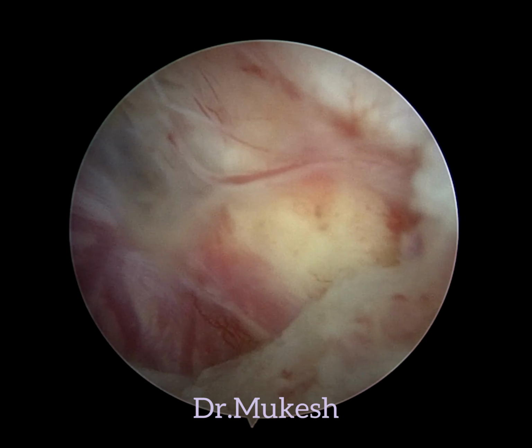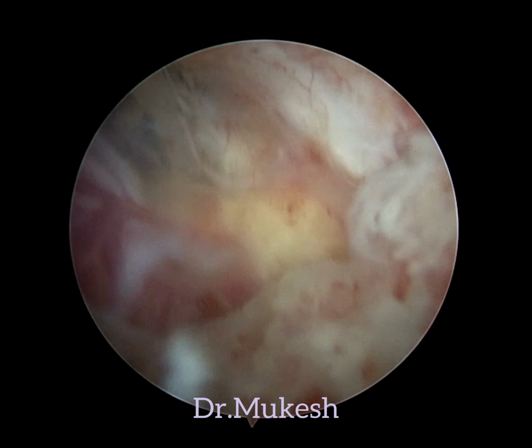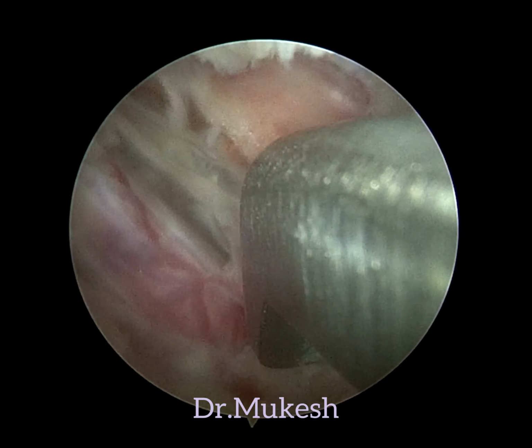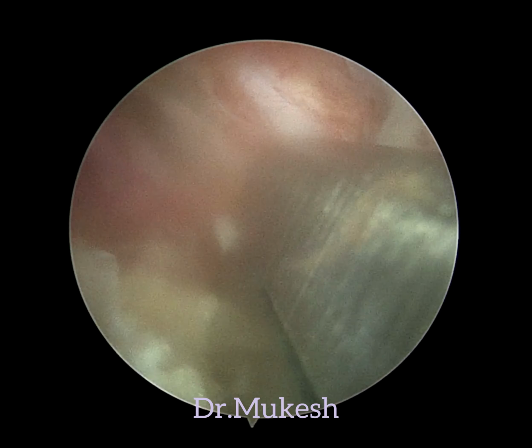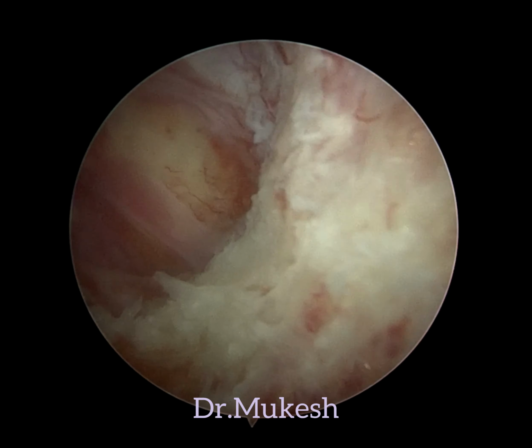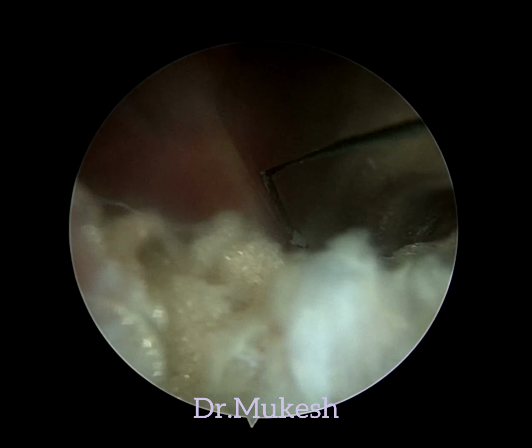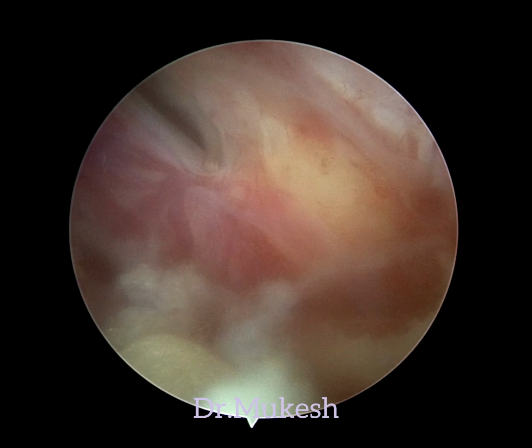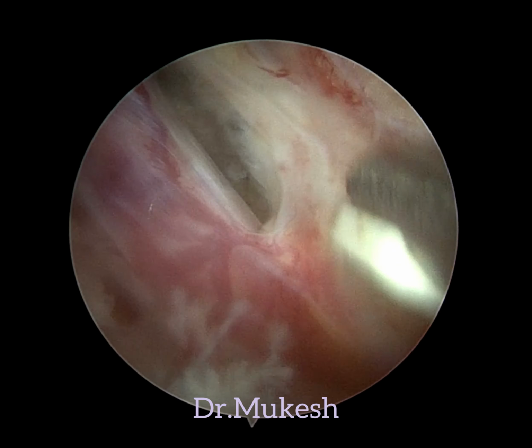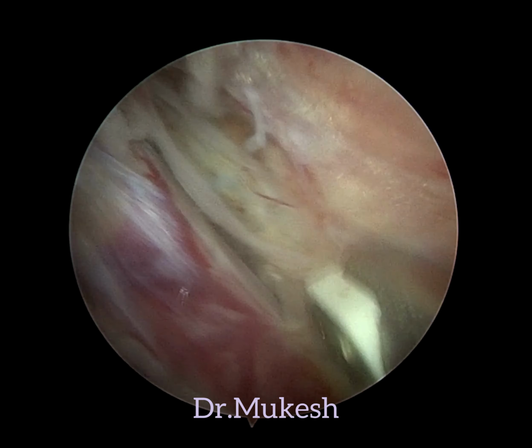and there was adhesions also, most likely because of chronic inflammation. So caudal lamina was further drilled and this was further decompressed. Then all the adhesions, they were slightly released with the help of radio frequency.